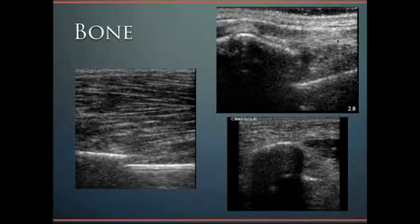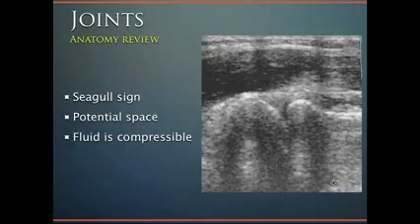In this particular patient, we can also make out the anisotropy seen on this area right here of its tendon, appearing falsely hypoechoic compared to this tendon portion and this tendon portion here. We would expect the tendon to continue to be hyperechoic, however, because of anisotropy, we see it's hypoechoic here. And then down here with the clavicle fracture, one part of the clavicle is here, there's a step-off, and then another part of the clavicle is seen down there.